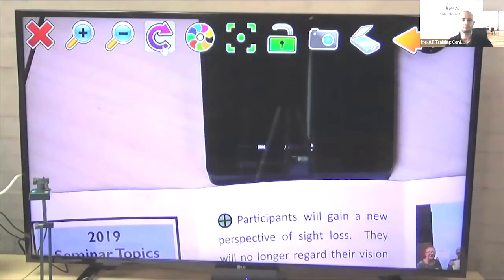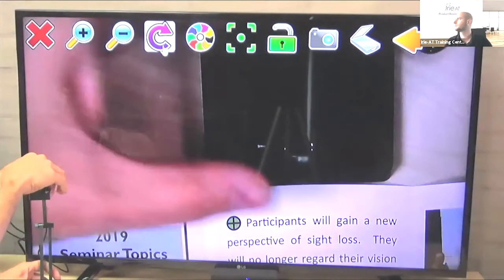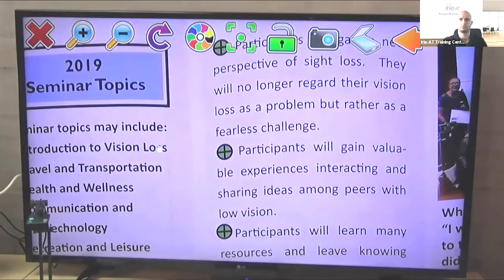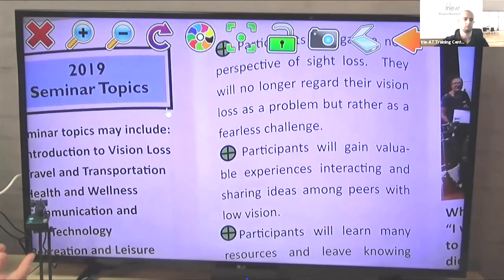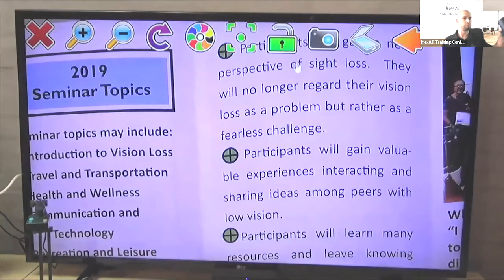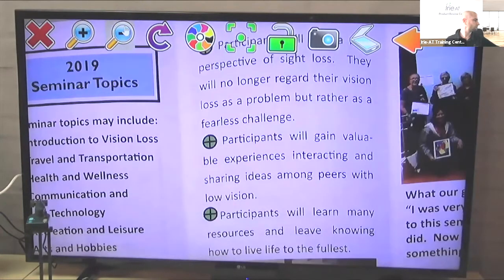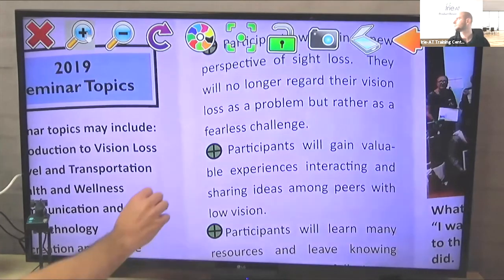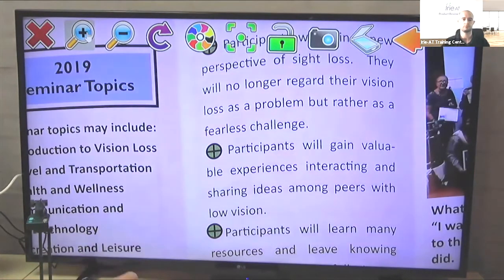Left mouse button. Rotate that so I get a better view on it. There we go. That looks great. So now I've got a live magnifier just by plugging in a webcam. I have the controls you would expect. You can pan around in the view. You can increase and decrease magnification. On a touch screen, this isn't a touch screen, but if I had that, I could be pinching and zooming and making those changes.